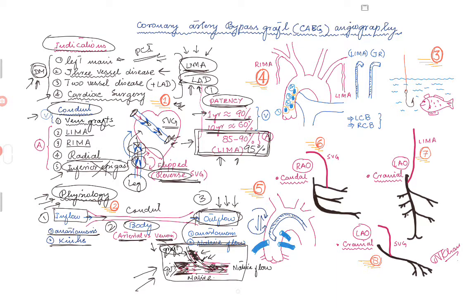So with that, we come to picture 3 here. Here we will be talking about angiography, especially in the cardiac cath lab. If you see this picture 3 here, it's just a little cartoon.